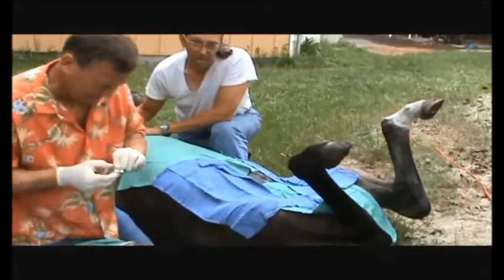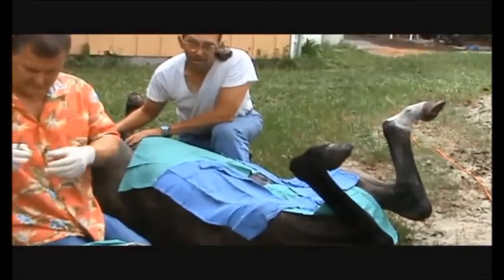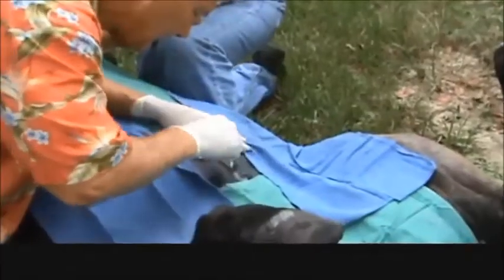Okay, this video is going to show a simple, or closed, or an uncomplicated hernia repair in full. This is the most common type we see in horses. There's no infection, there's no umbilical stalk, it's just a wall defect. So really all you have to do is clean that up and close the wall defect.